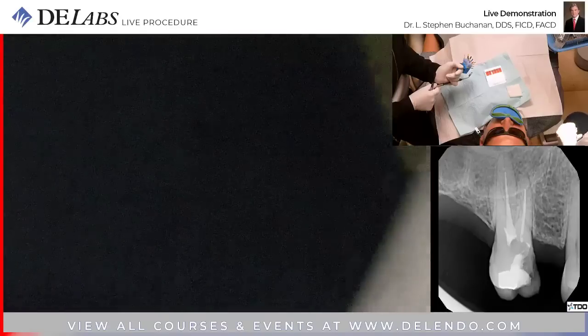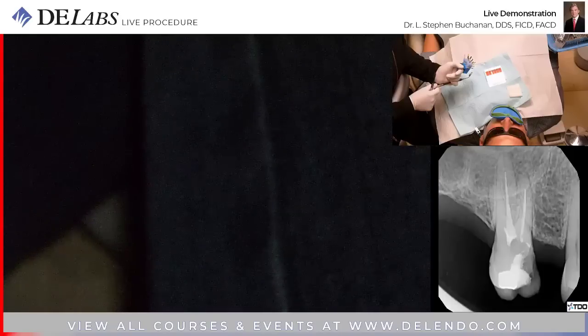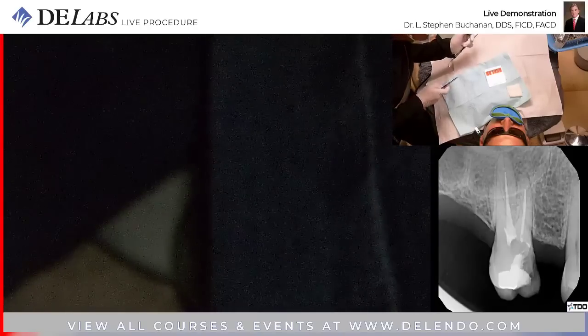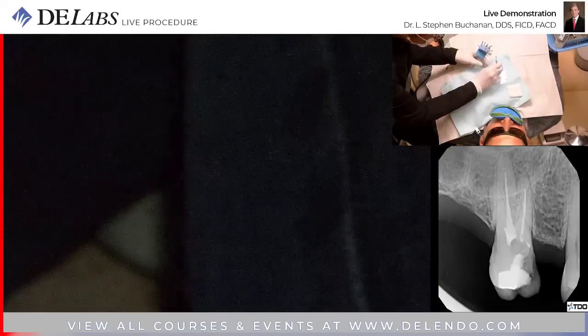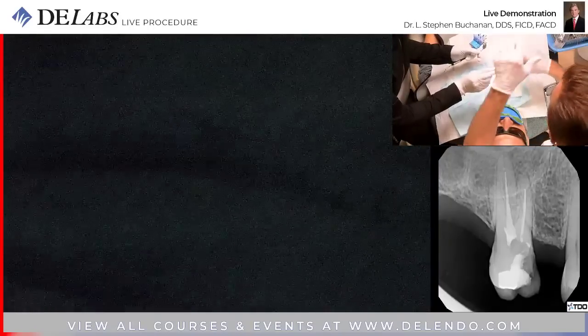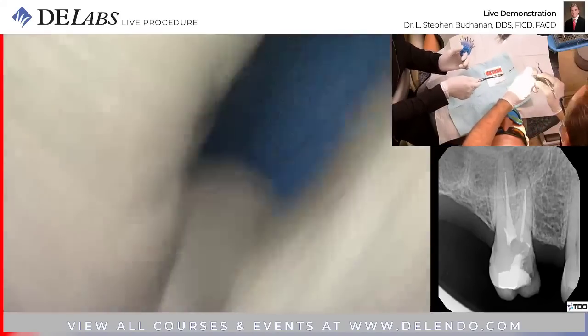Okay, that's the distal buccal. Power is 21. Okay, and we have a 30.08 there. Okay. And we sit at 21.